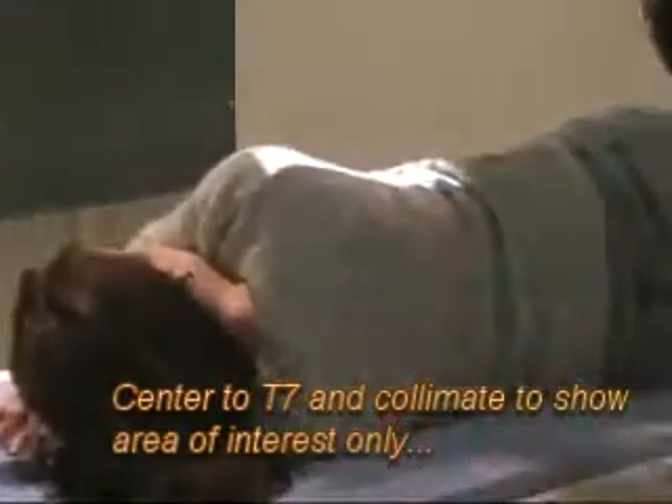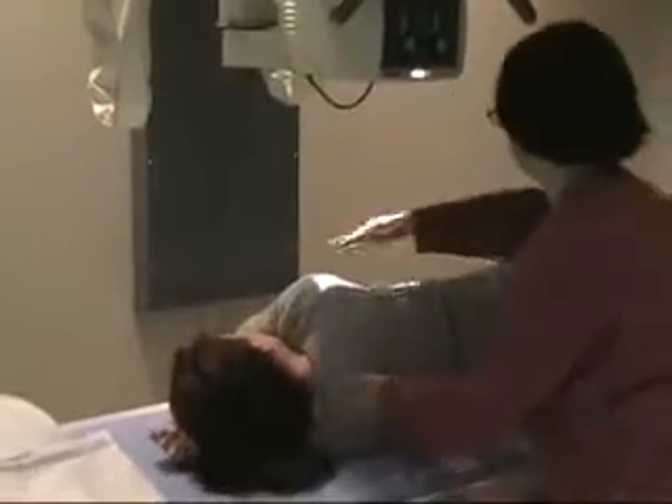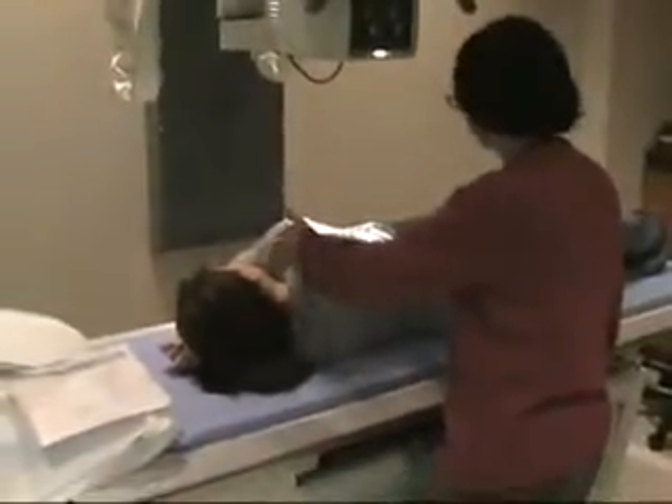Put a marker on the anterior side — left marker — and push it right over a little bit. Once again, if you've got big shoulders, you're not really going to see the very top very well anyway.